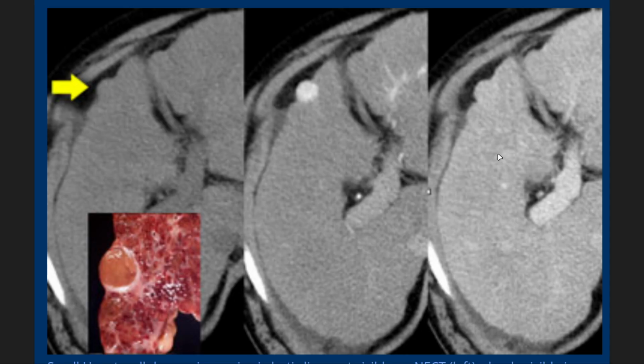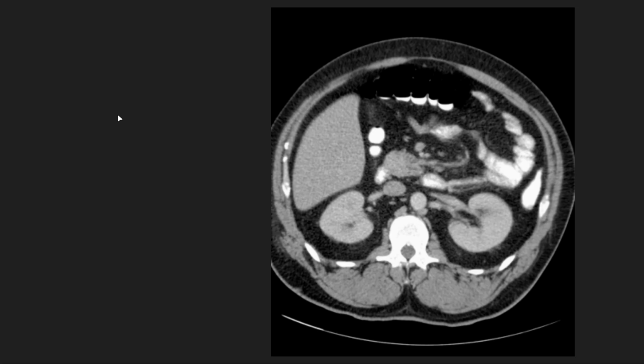And you can tell this is the portovenous phase because you see here there's a blood vessel. This blood vessel is the portal vein. So you can see it's much brighter in this picture compared to the one on the left. So in a portovenous phase, you can notice that the liver is also much brighter than the previous image, and you notice that they all have the same density. So overall, this was a case of HCC on a cirrhotic liver. So this is why knowing the phases is important. All right. You can differentiate many different lesions in the liver, spleen, kidney, a lot of things.